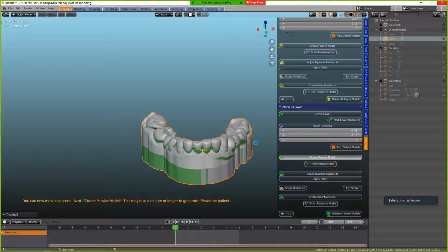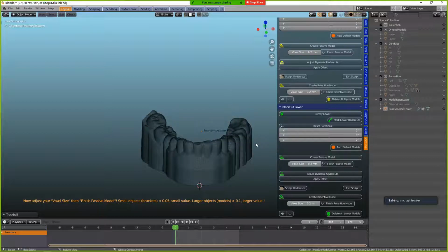Oh gosh, we're working very hard, but it's just growing and growing. And now I've decided I want to be able to make thimbles, you know, these thimbles in a wax up, so that if you want to make a frame out of zirconia, you want thimbles, like little miniature preps inside the teeth.